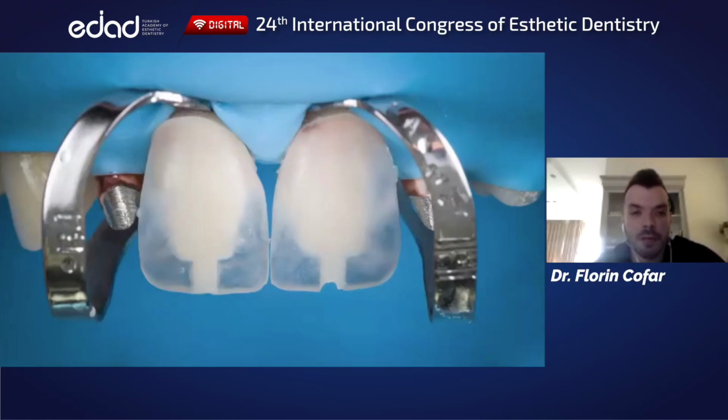Of course it has to be a resin. And then I use Tokuyama OPA2, which is for me one of the best composites for this job, because it has both chroma and easy handling and very nice opacity.